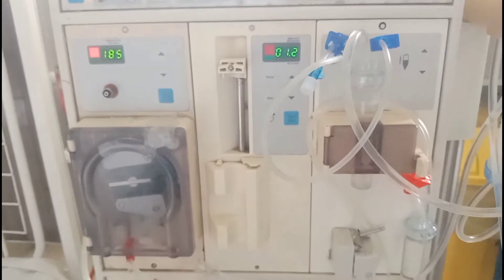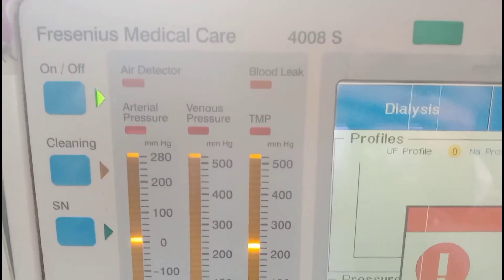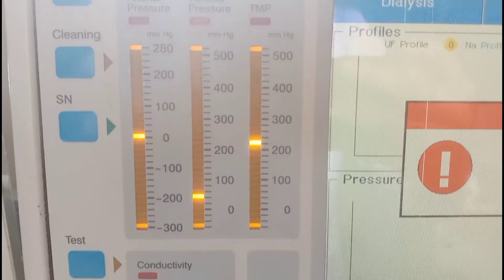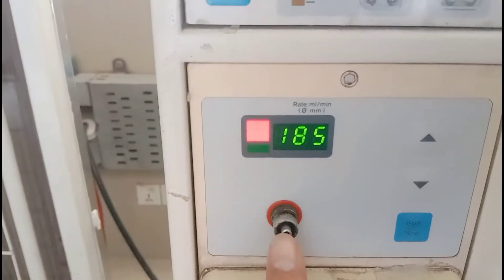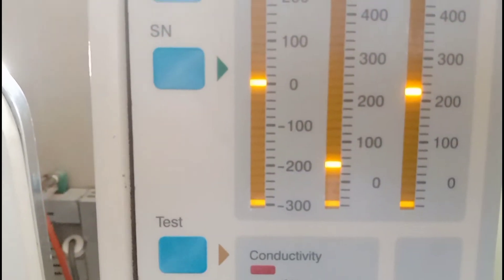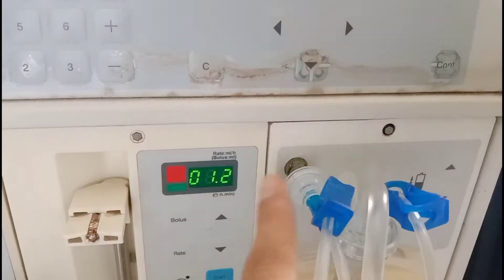Hit the start or stop button for heparin infusion. Here you can see the arterial pressure readings, and ranges are shown on the screen. Here is the place where the transducer for arterial pressure is connected, and arterial pressure is shown on this panel.